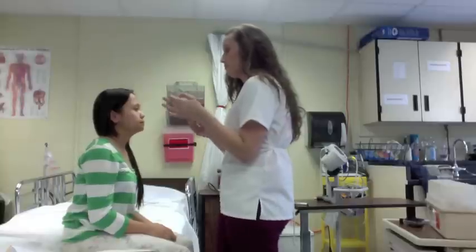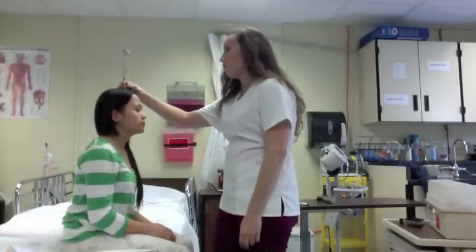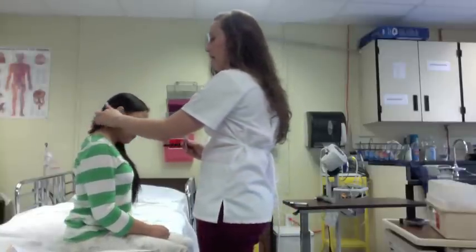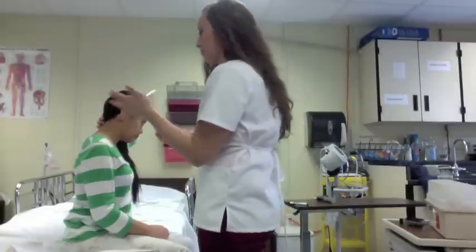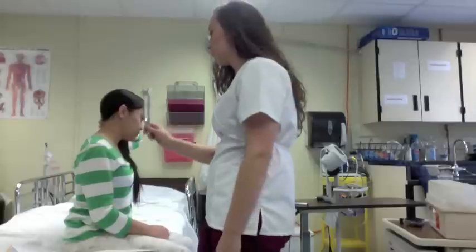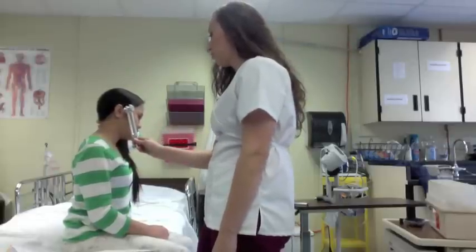Next, I will use a tuning fork to do the Weber test, which will test for hearing in both ears. You hear it on one side more than the other? See both sides. Good. Now I'm going to use the tuning fork to do the Rinne test, which tests hearing by using bone conduction and air conduction. Tell me when you can't hear anymore? No? You can't hear. Good. And Karen heard when the tuning fork was closest to her ear for a longer amount of time because air conduction is greater than bone conduction.